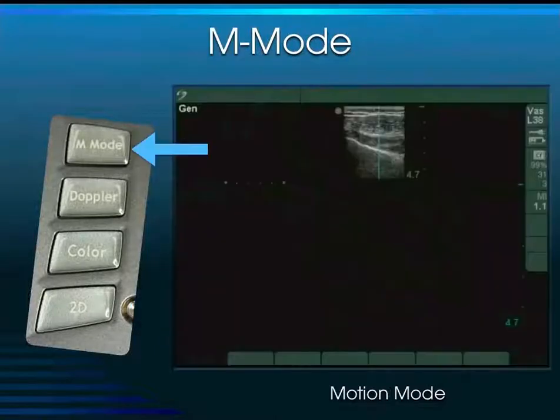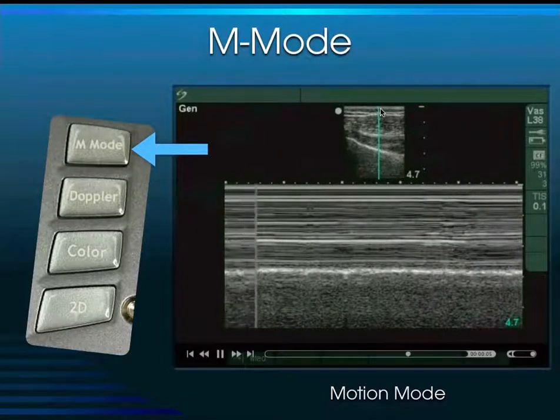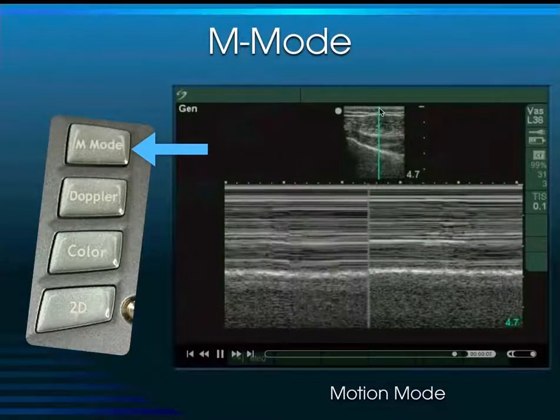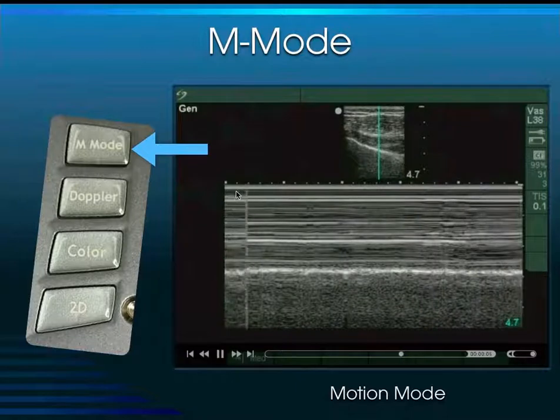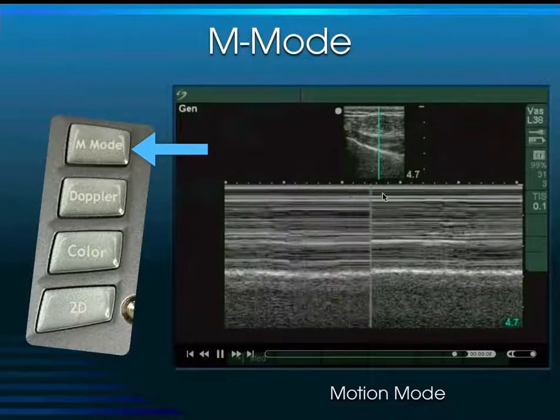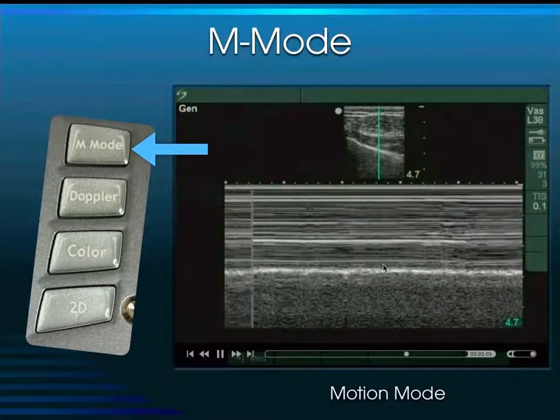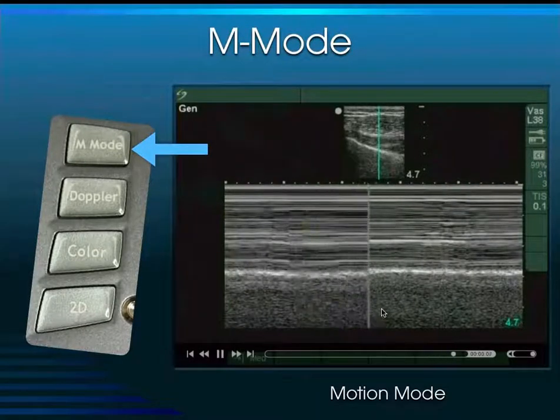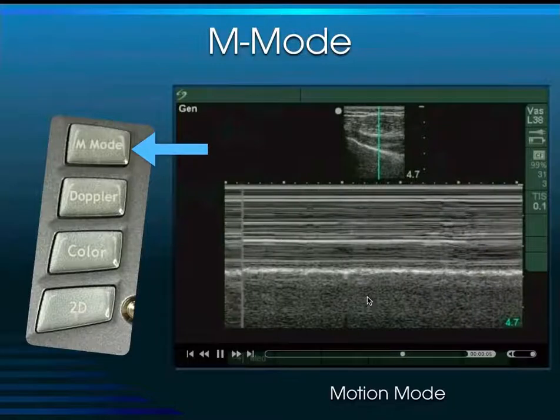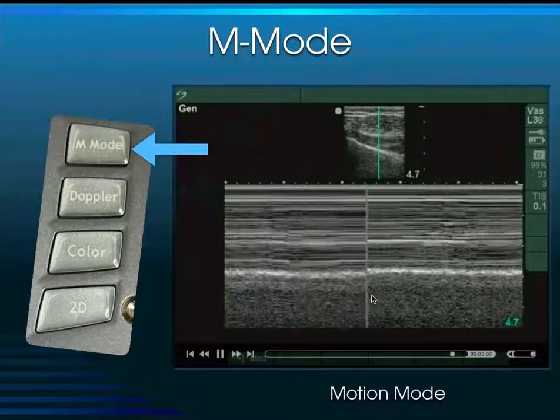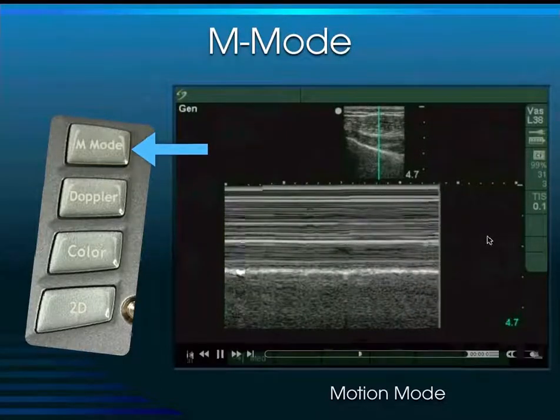The next button you may encounter is the M-mode, which stands for Motion mode. The part of the spike that corresponds to the top of the tissue corresponds to a graphical representation of motion. This is a two-dimensional tracing of anything moving on the screen. Structures like the pleural line slide back and forth, appearing as a sandy appearance at the bottom of the screen. Motion appears granular whereas static structures appear as horizontal lines in motion mode.